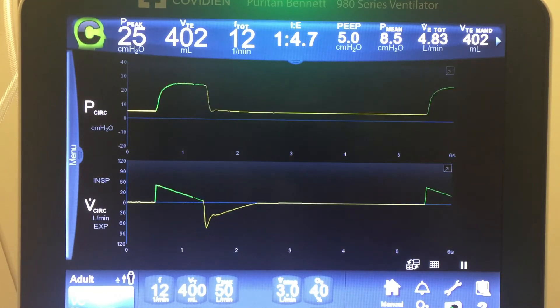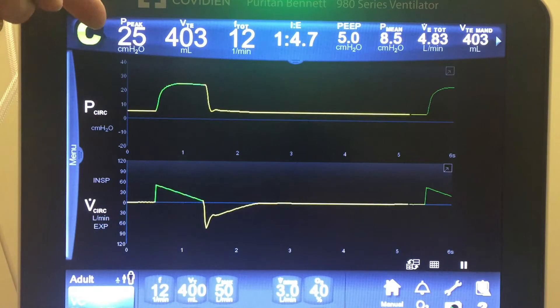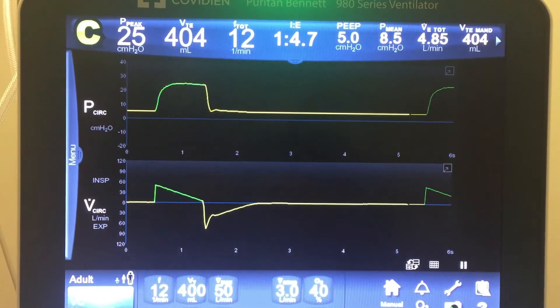Before we go through VC Plus, I want to talk about regular Volume Control, or VC. Right now the ventilator is attached to a test lung and delivering a 400 milliliter tidal volume, reaching a peak pressure of 25. In regular volume control, the breath targets a tidal volume of 400 and is also cycled off when it reaches that 400 mL tidal volume.